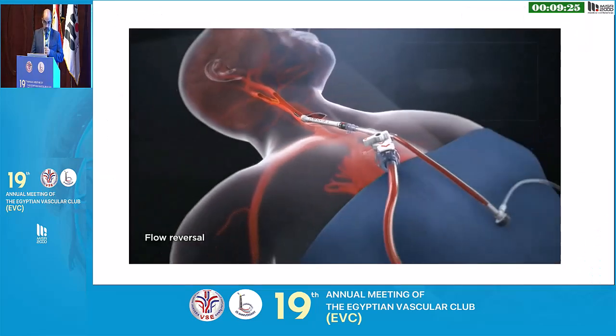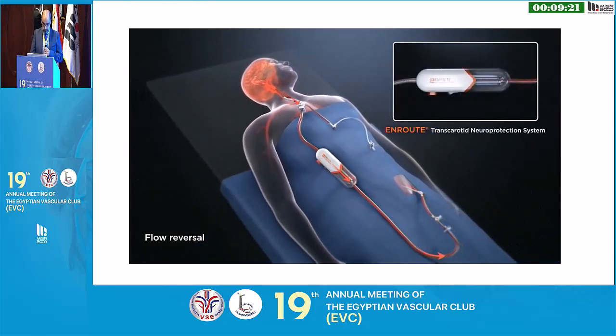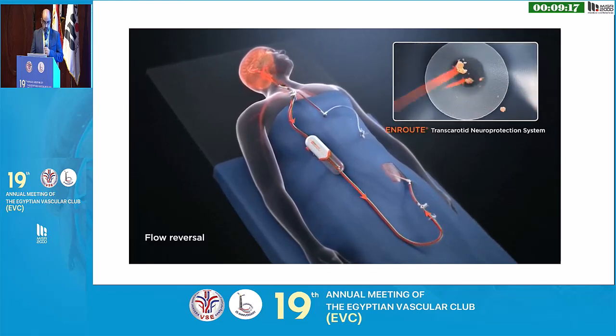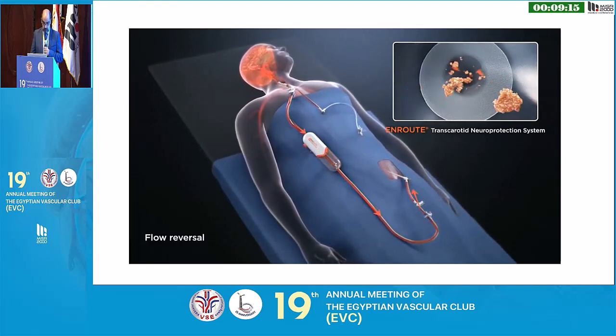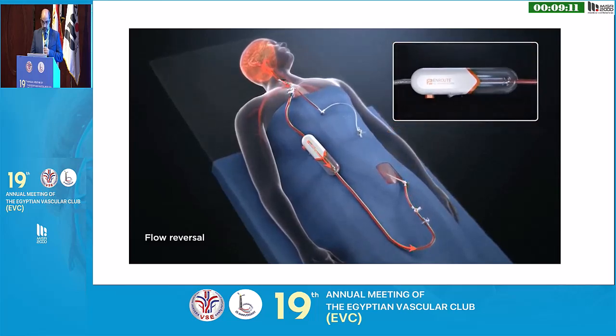This is a sample video for the reversal flow system that directs the blood directly from the common carotid artery to the femoral vein, and the blood is filtered totally in the filter.